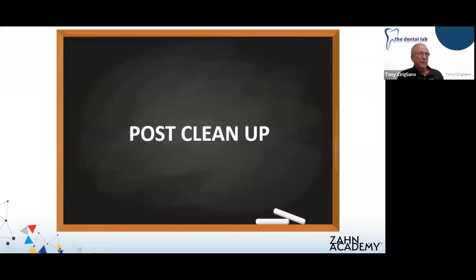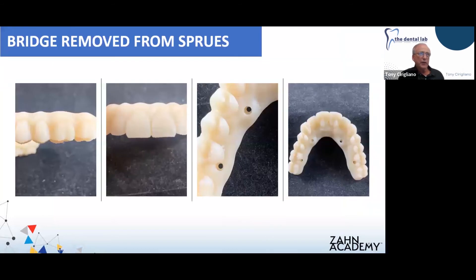After the case is cleaned up, this is what it looks like — the sprues are broken off and you can see all those little projections. When you snap the sprues or connectors off the bridge, that's basically what you're left with. It's a fairly easy cleanup — not as difficult as you might expect, and it finishes off really, really nicely.